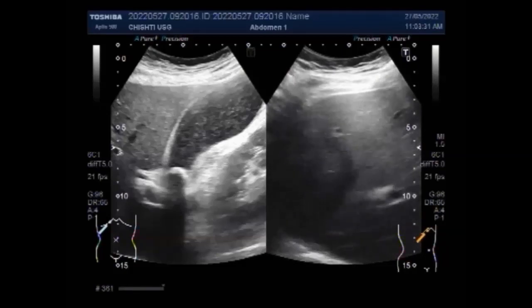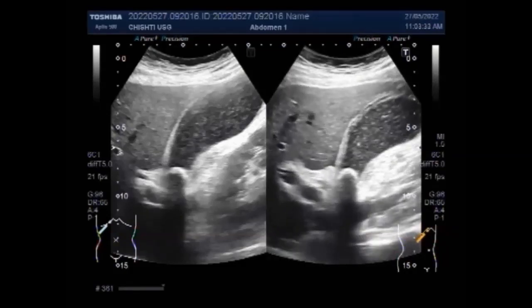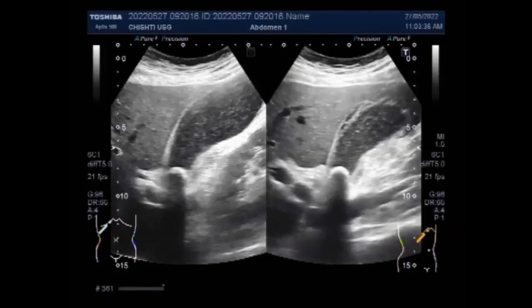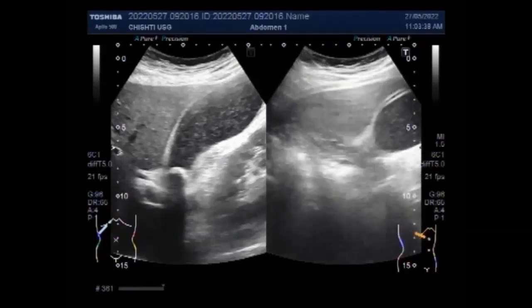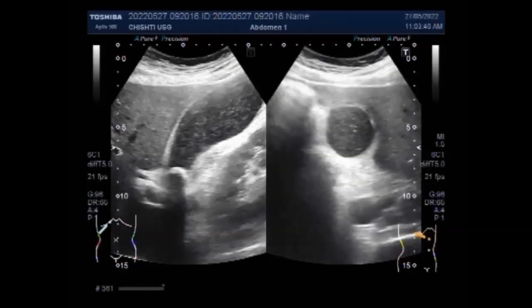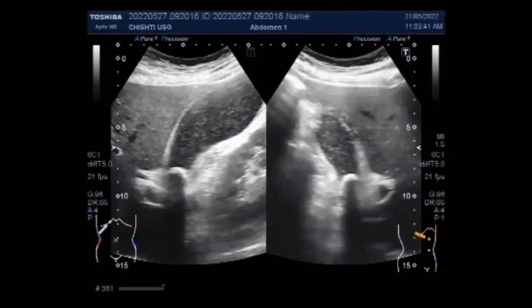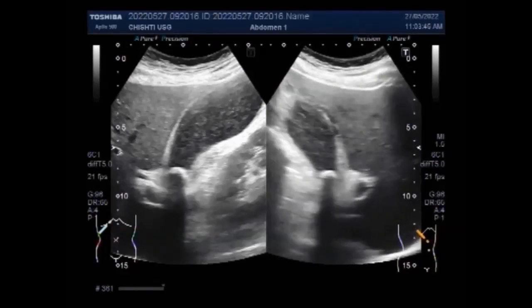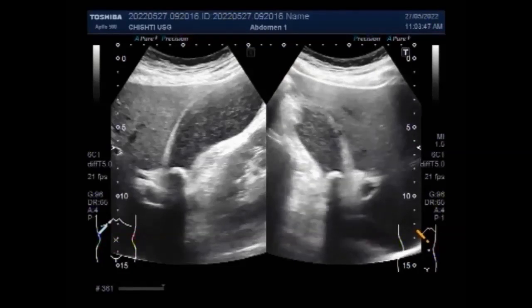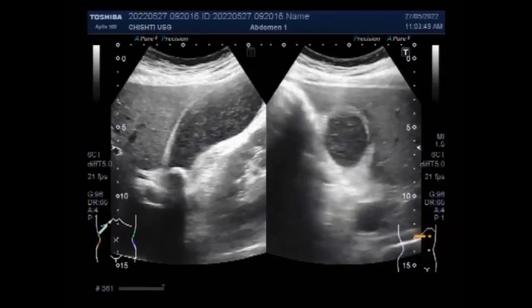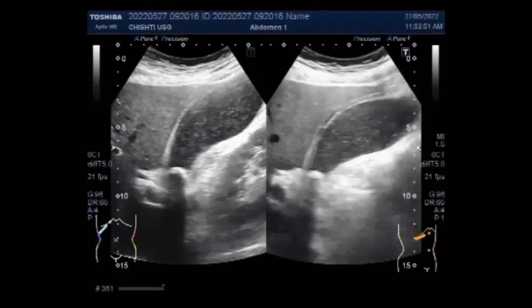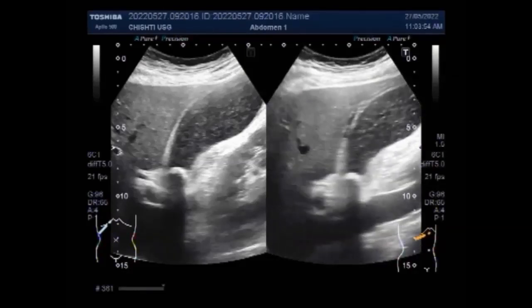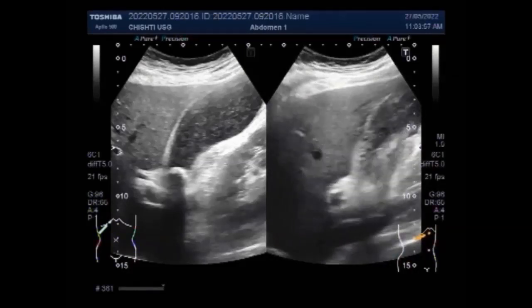Again, you can see the patient is in the side-down position and a large stone with shadowing is seen impacted in the neck of the gallbladder, and the gallbladder is over-distended and shows thick sludge in the whole length of the gallbladder.